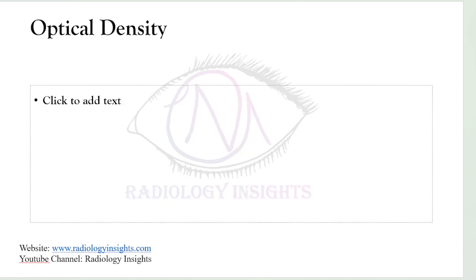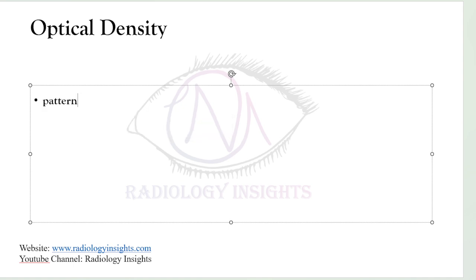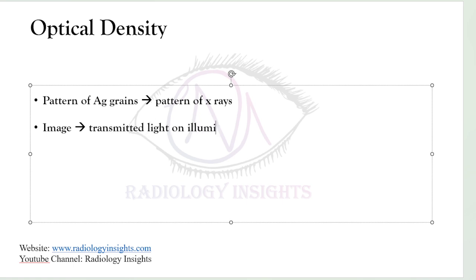The last topic is optical density. The film now carries a pattern of silver grains which corresponds to the pattern of X-rays leaving the patient. The image is viewed by transmitted light on an illuminator or a light box. It is a negative image. So the image that you see on a light box is a negative image, where the X-rays have been most intense and the film is darkest.